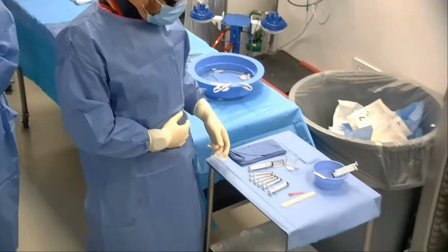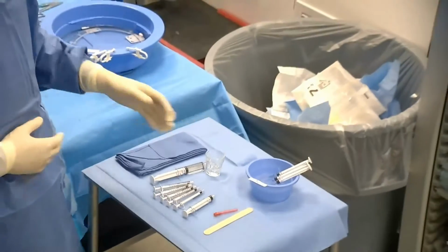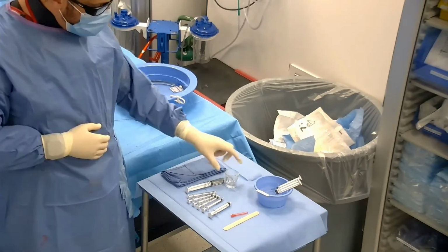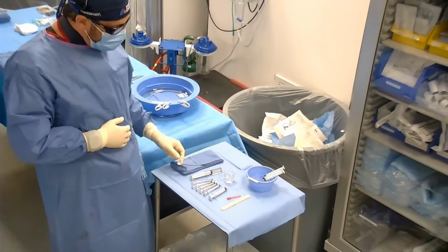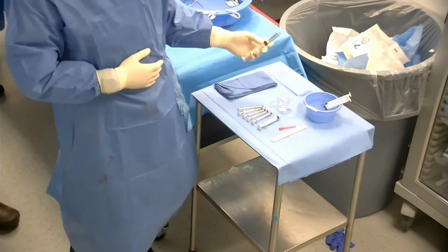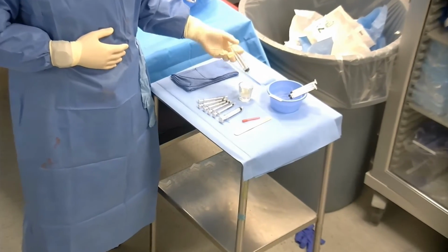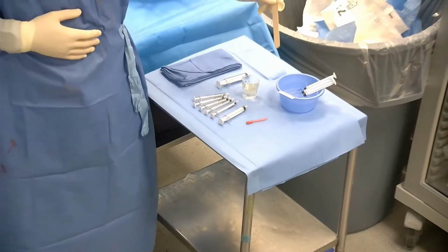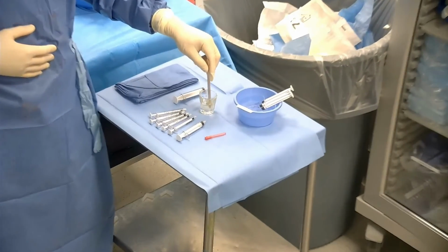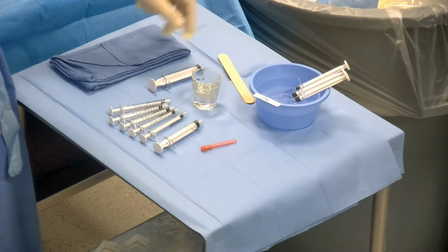Okay. So right here we have our glue table. We set this up separate from our main table because we don't want any saline or blood. We typically change our gloves too to make sure that there's no blood here. In this shot glass, I have 1 cc of n-BCA. This is 10 cc's of oil, Lipiodol. So we're going to basically make it 10-1. I like to keep it 10-1. It just makes it easier. It's easier math. Let's put it that way. In groups of 10. That's just the way my brain works. So we mix it up. And that's it. That's our embolic.